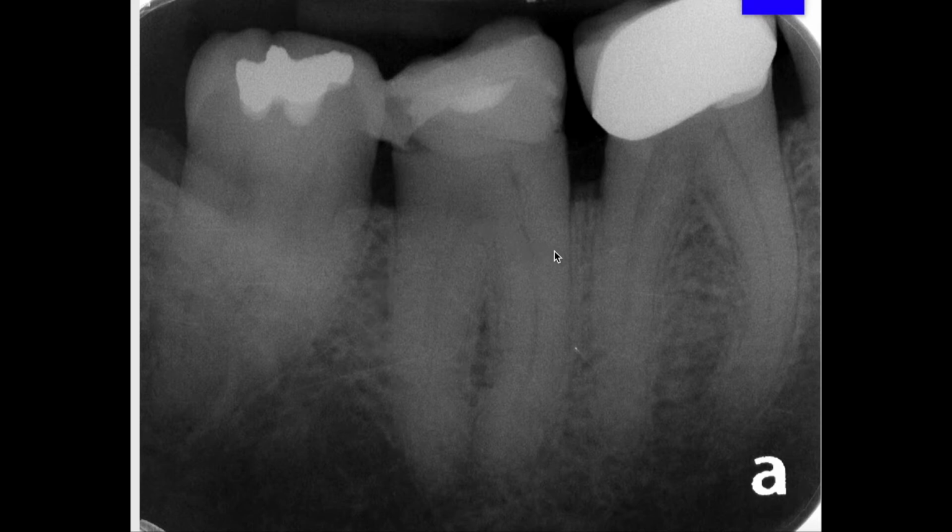So what I do, and I've had great success with this, is to go mesial to that tooth. If I'm going to go mesial, I'm going to make sure there's sufficient intraradicular bone to make sure I'm perforating into cancellous bone. Now, if you hit a root, you're going to know because it won't progress. A tooth root is significantly more dense and tough, more difficult to perforate than cancellous bone. So in that case, we remove the perforator, start with a new one, and place it in a different location. Don't quit, because the patient still needs to be treated.